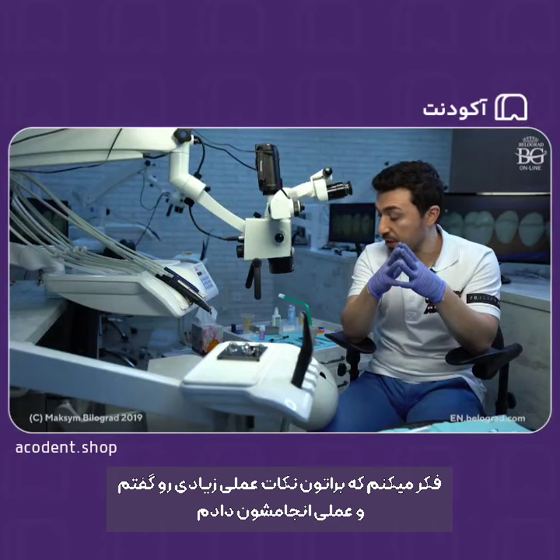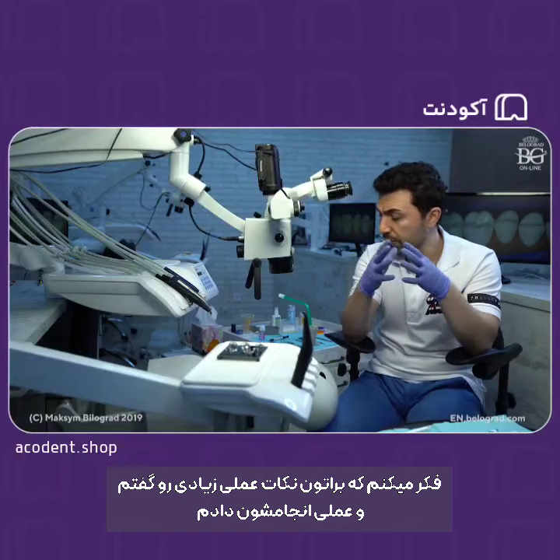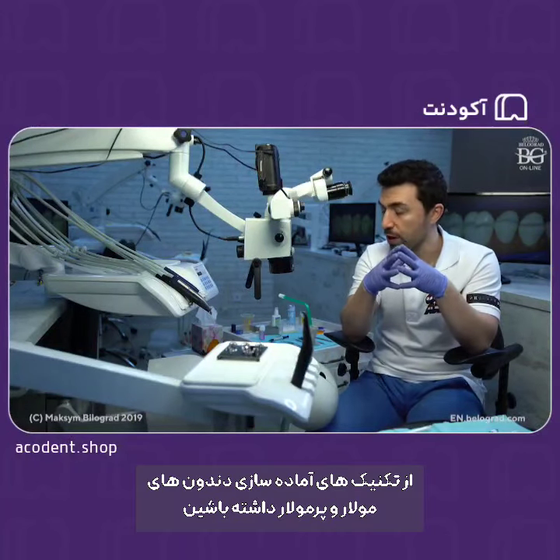I think that I discussed and showed a lot of practical things, so now you will have a certain understanding regarding the type of preparations and techniques of preparation for premolar teeth.